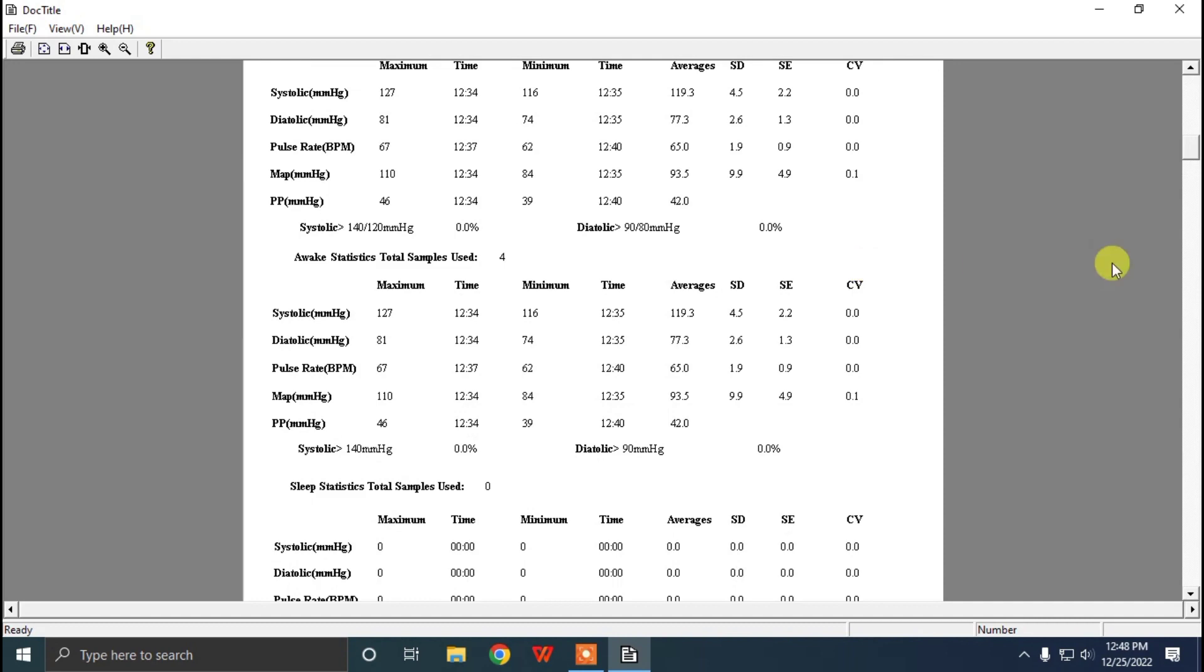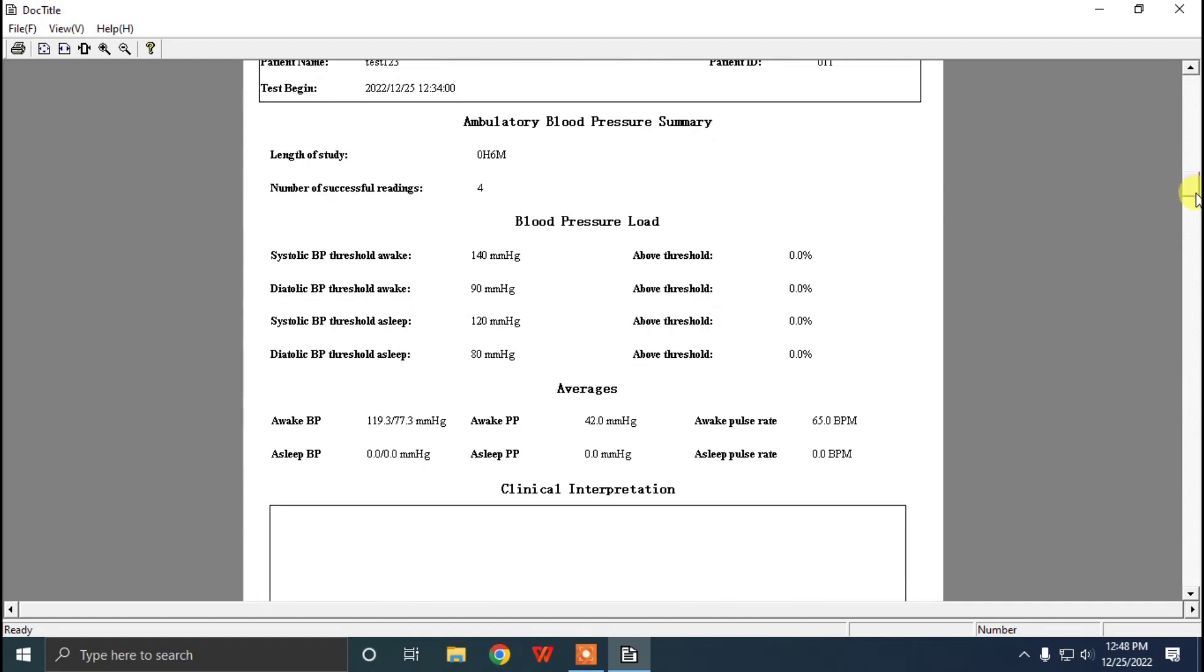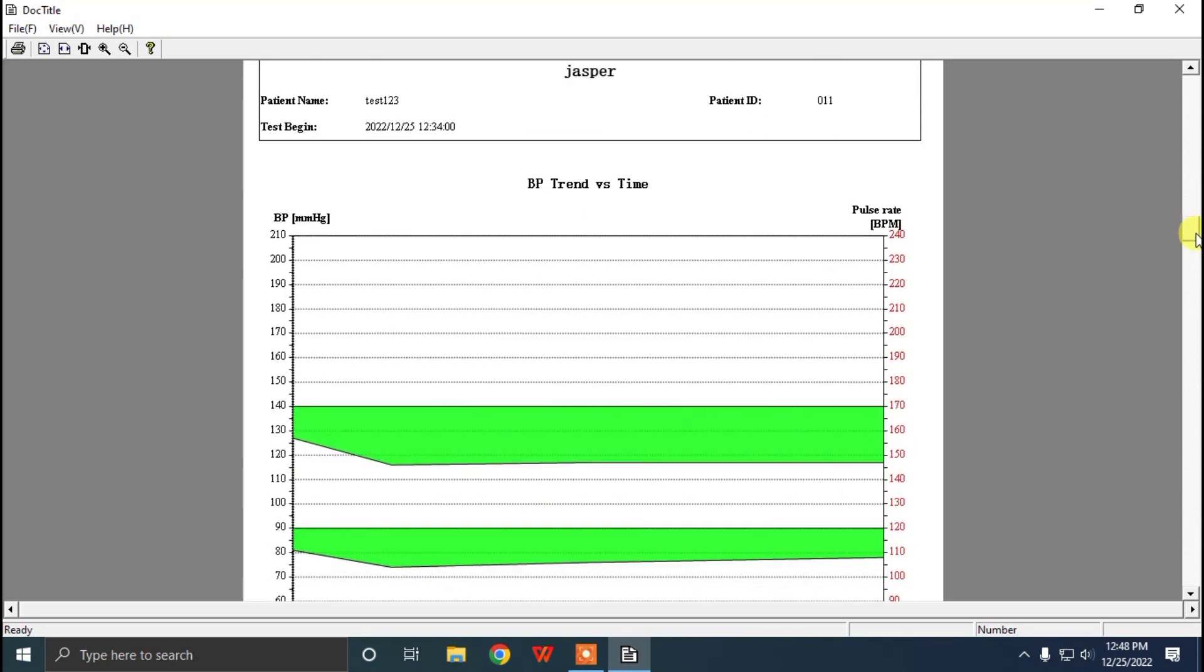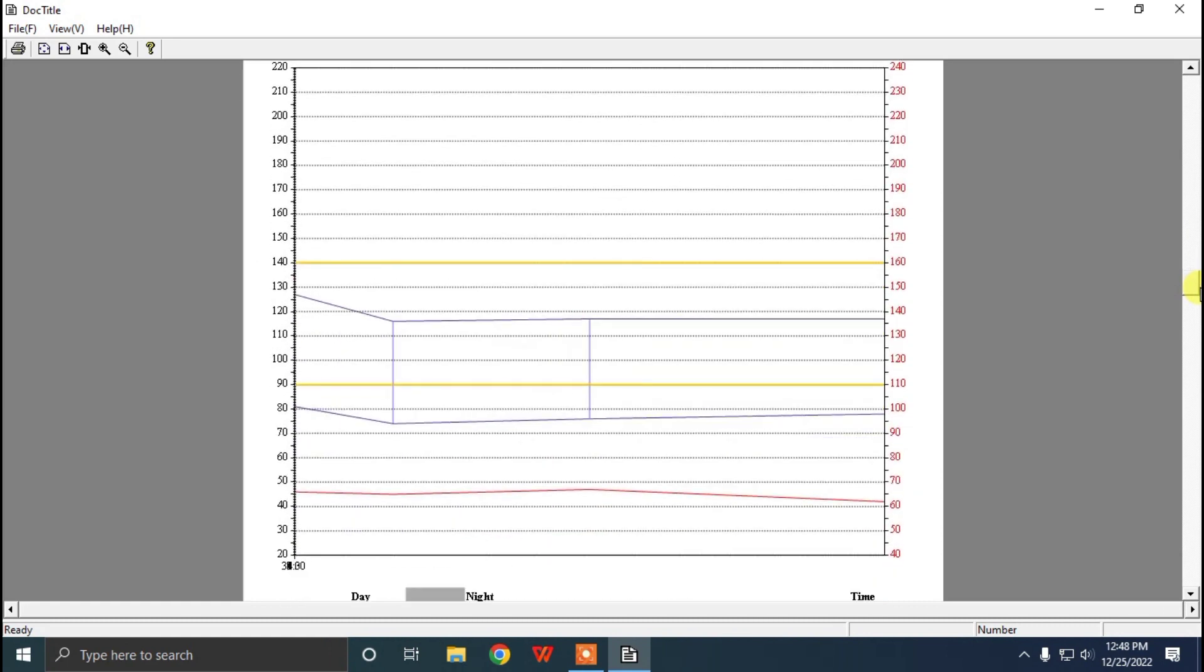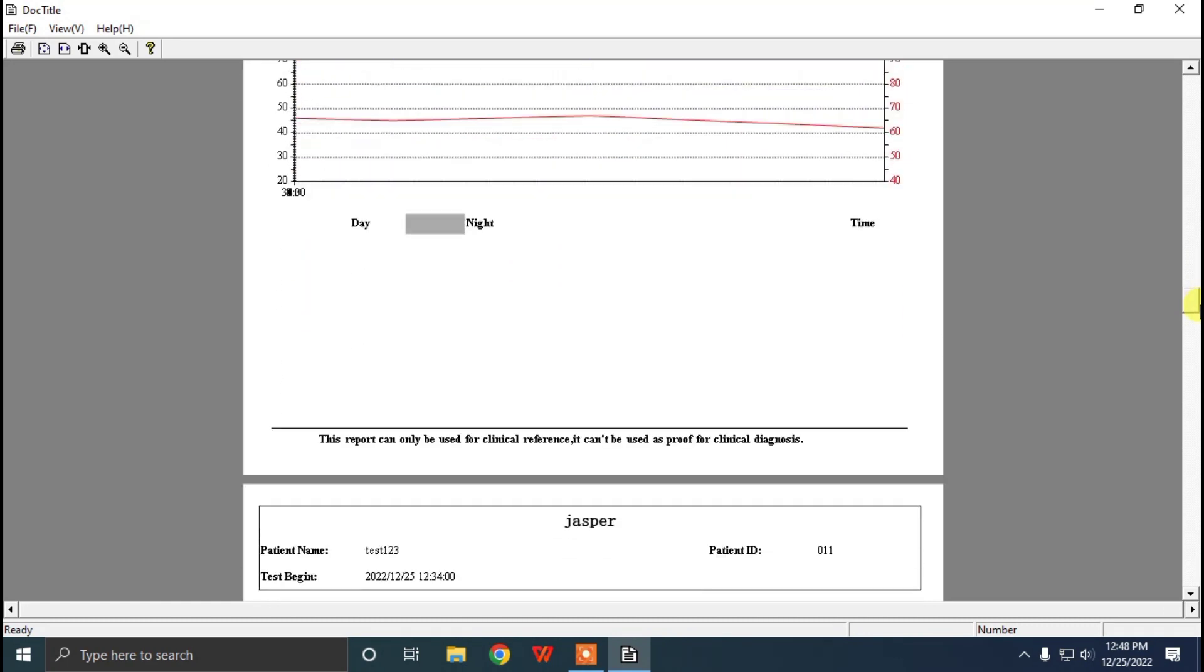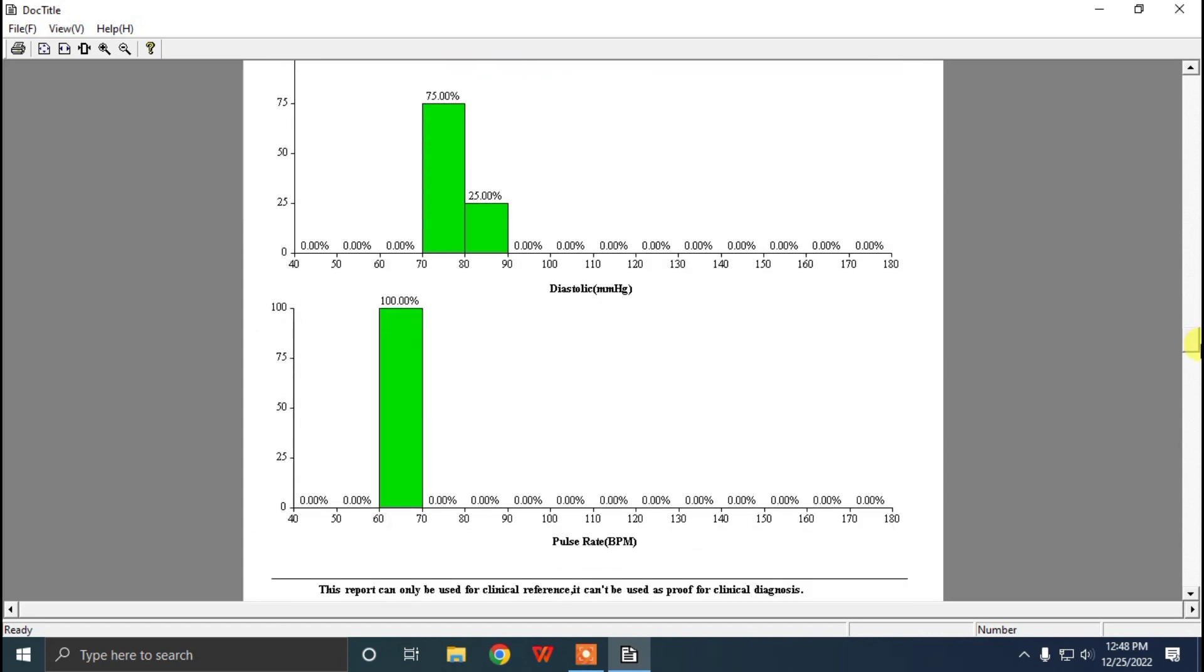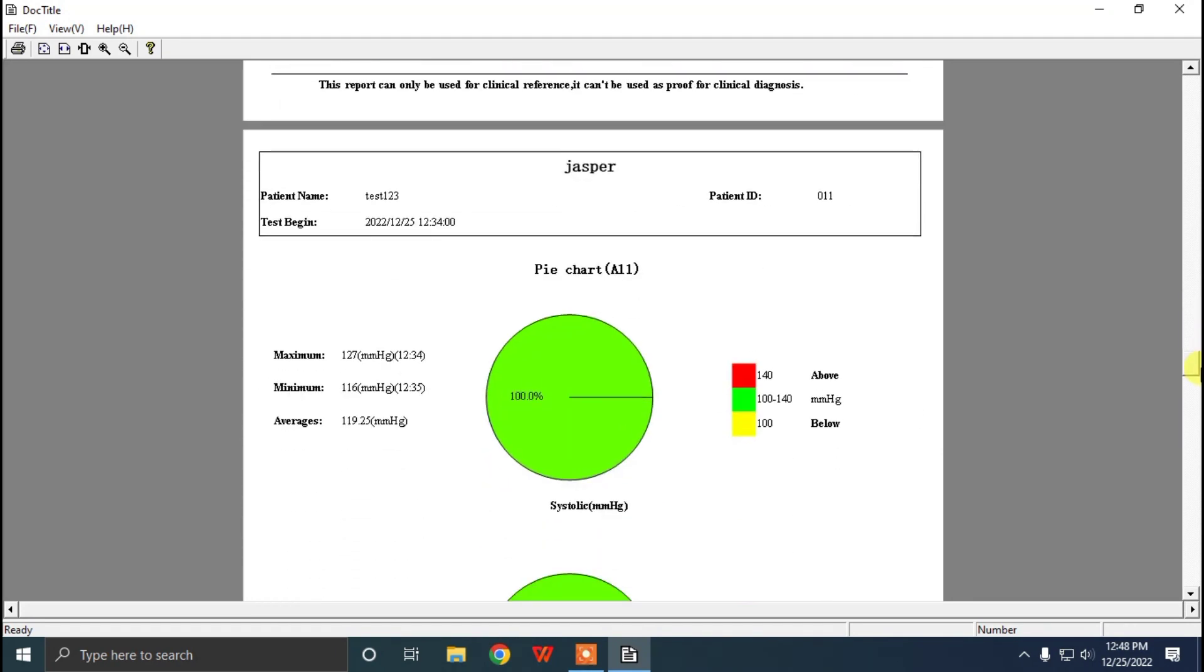Now you can see all the information here. As we have only taken some few data, we are getting only a few here. But if you have taken 24-hour supervision of the patient, you can get more data as you have defined the intervals, awake time and asleep time.